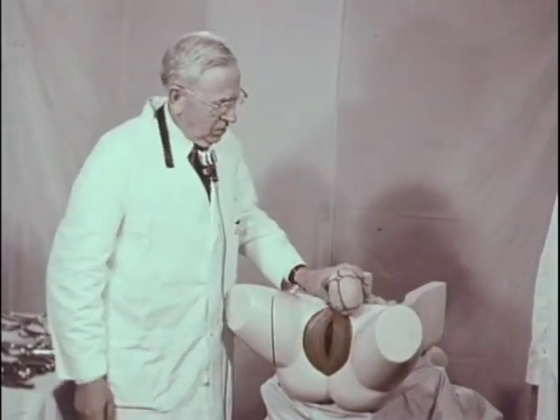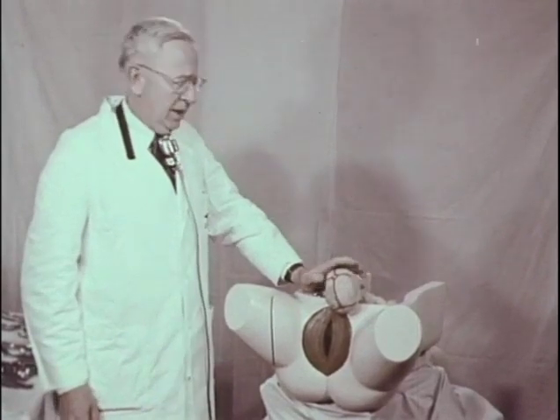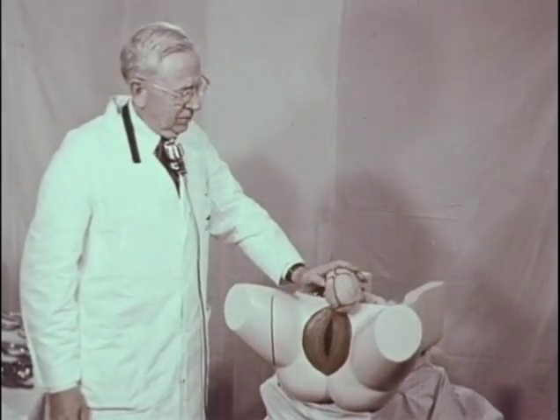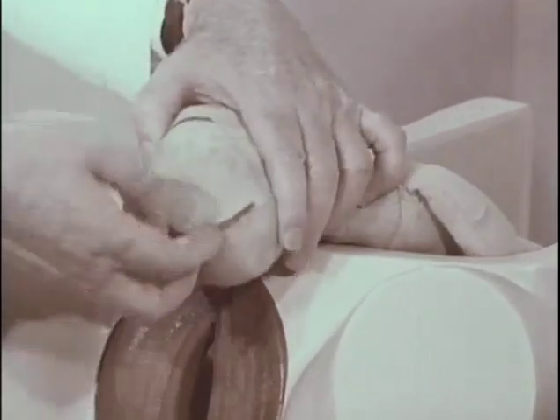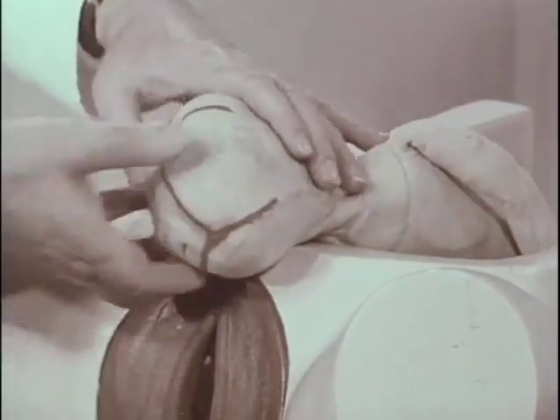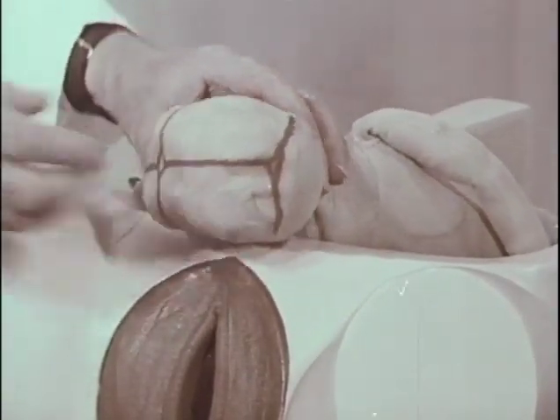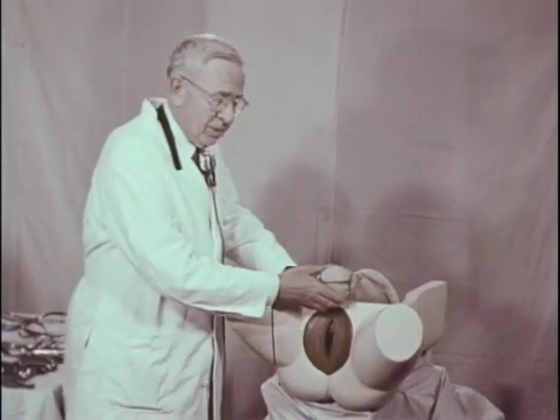Here we have still more maneuvers in order to rotate the occiput posterior to anterior, and they can be classified in a similar manner as for the transverse. We have the manual rotation to anterior, either by the digital or the manual method, followed by the application of the Simpson forceps because of the molding. Or we have the combined manual or digital rotation and instrumental rotation to anterior, using the Elliott forceps for the instrumental part.